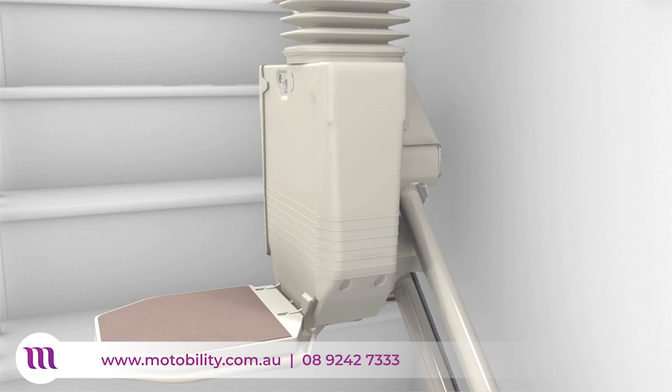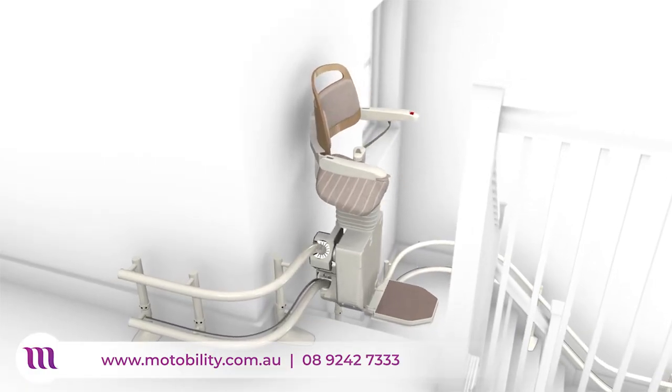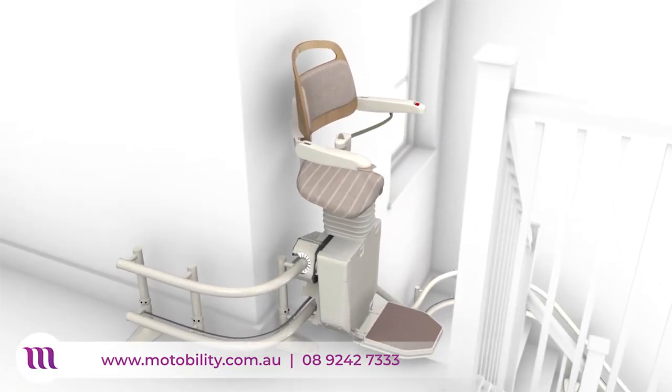The slim design is also a great alternative for homes where the staircase is too narrow to accommodate a traditional stairlift.